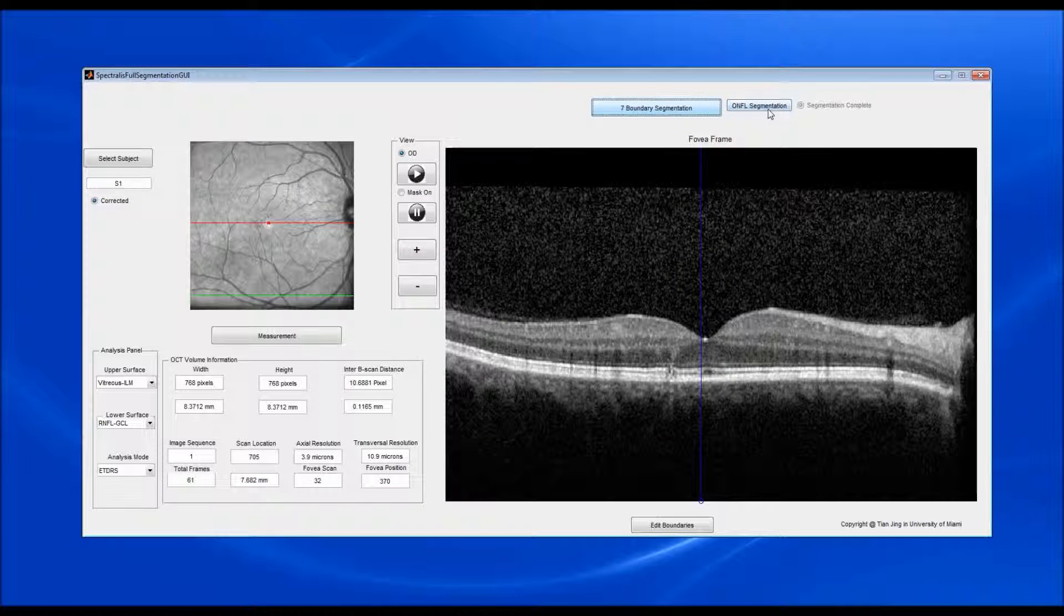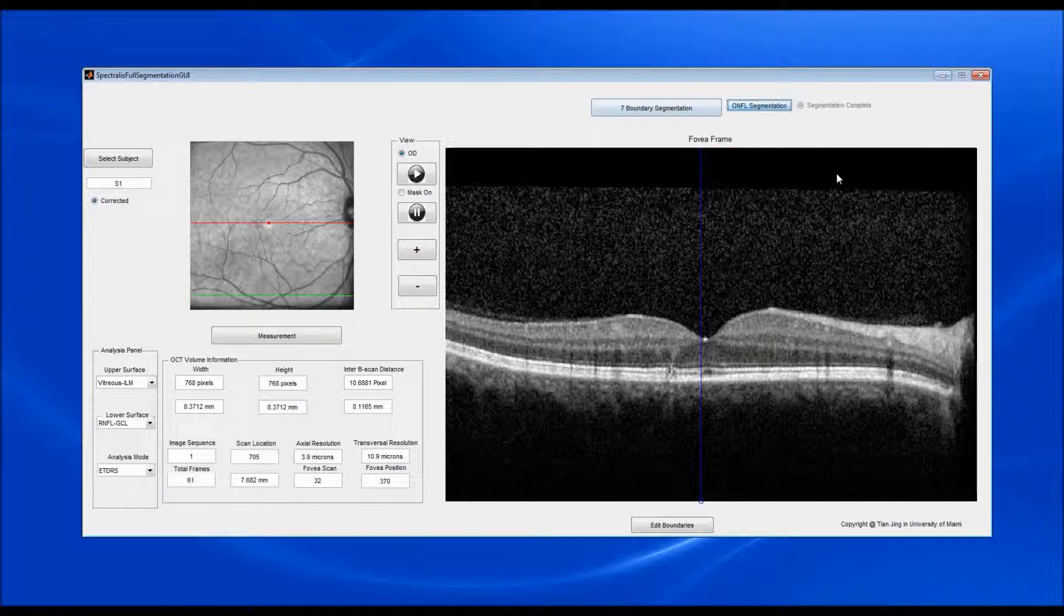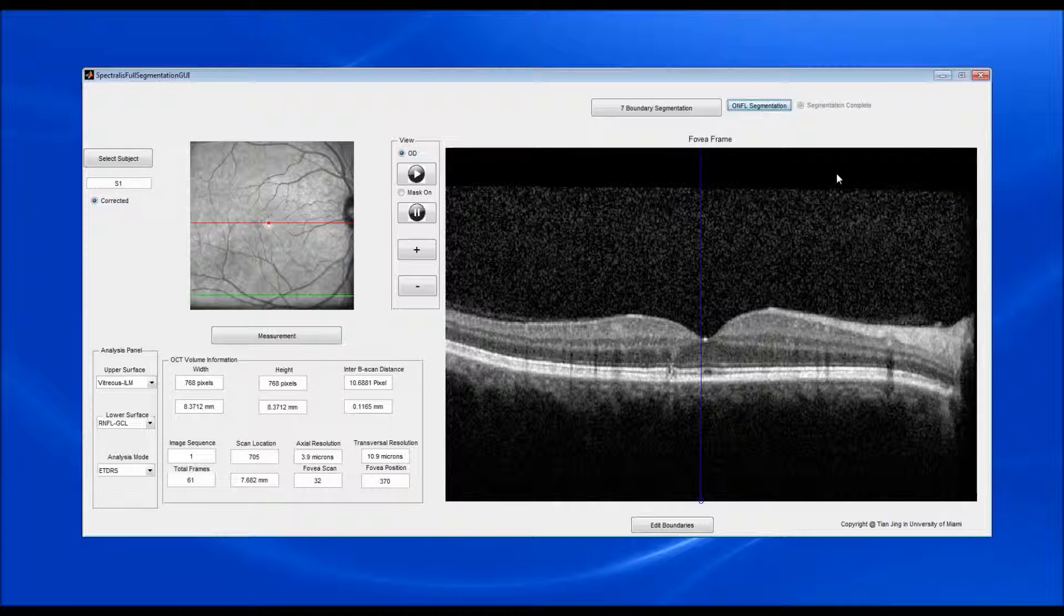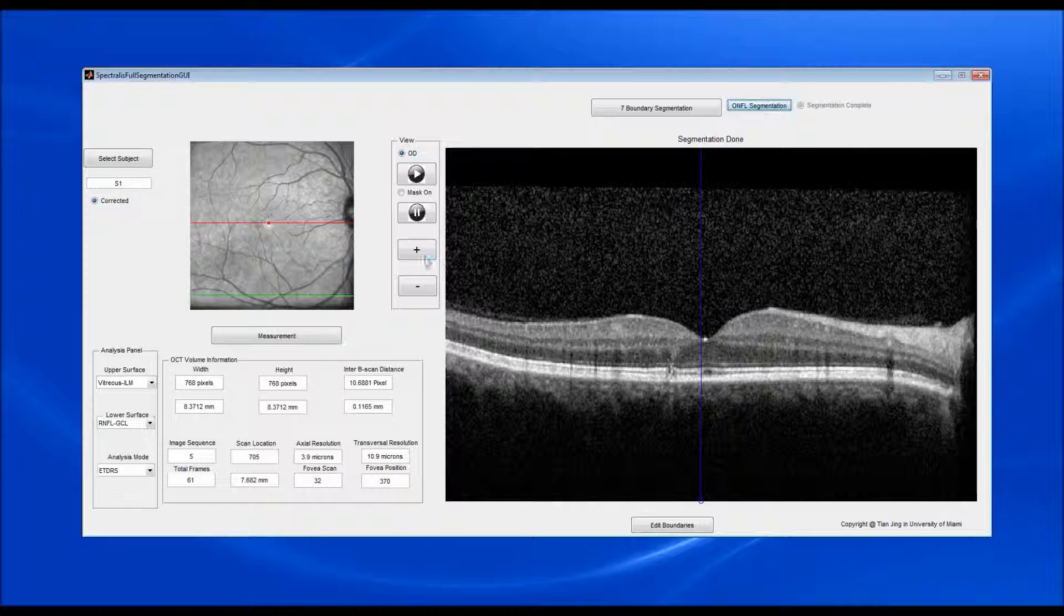Now, click the RNFL segmentation button. The outer boundary of the RNFL is segmented automatically. The whole process takes about 24 to 28 seconds.